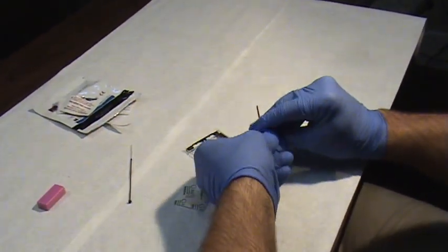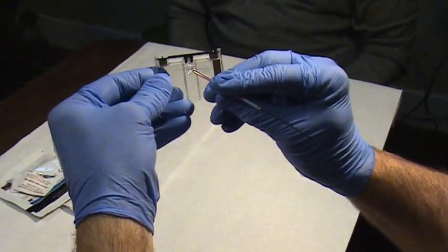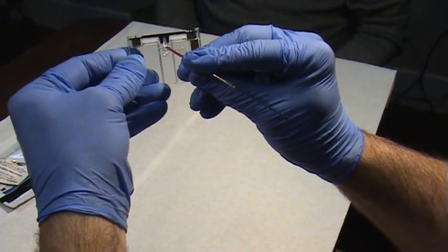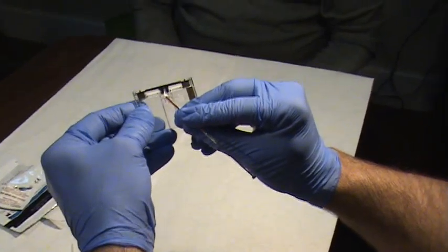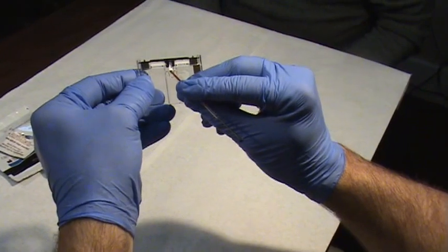You take the cassette. If you look closely, you'll see that there's a reservoir for the blood to go, a finger's pointing to it, and you'll see the white gauze. Apply the plunger directly at the base of the gauze. Do not place it here because you may run out of blood for the sample.